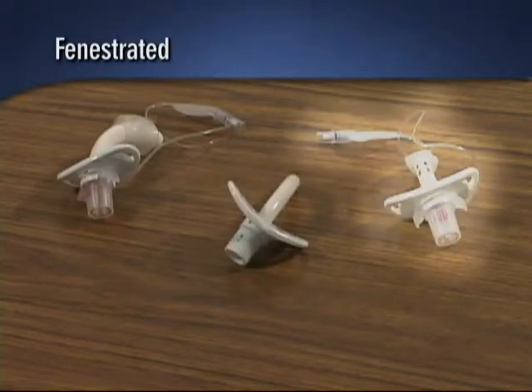The fenestrated type allows limited speech as air passes through the upper airway when the cuff is deflated and external opening is capped. Whichever type of tube is intact, the goal of tracheostomy care is to prevent infection and skin breakdown at the site and maintain a clean, dry, stable airway.